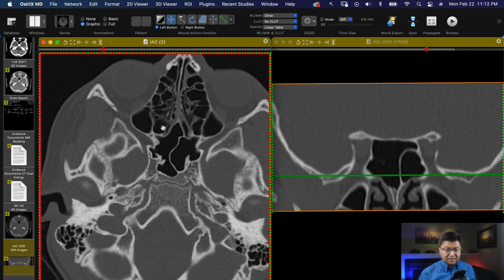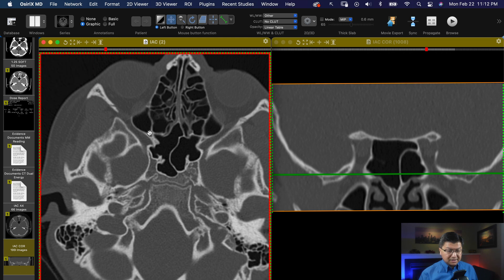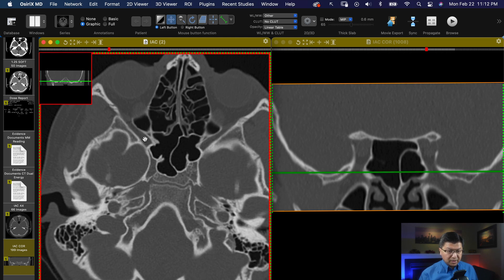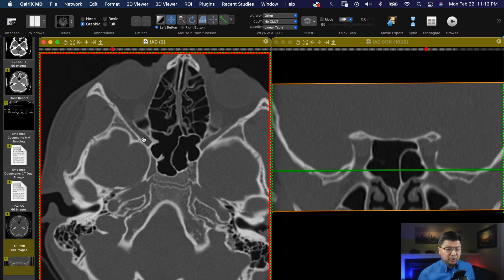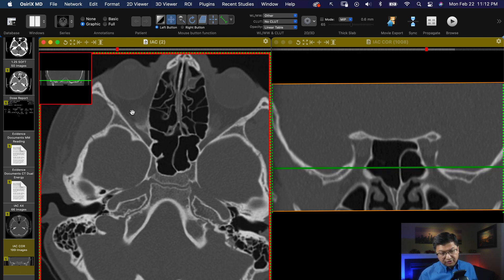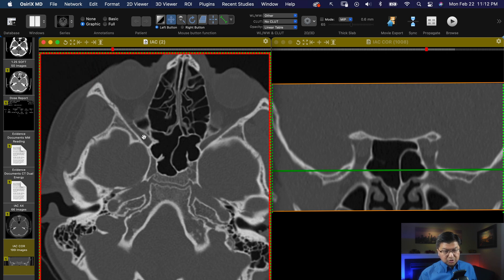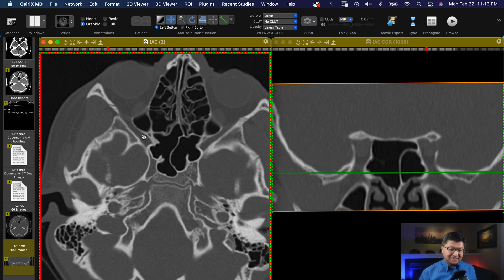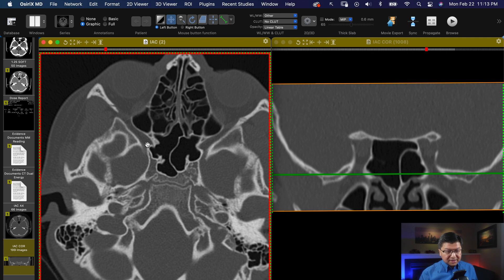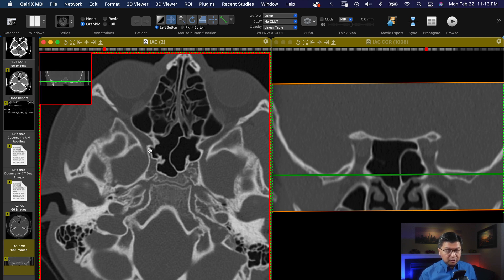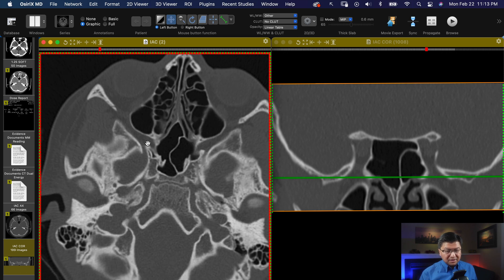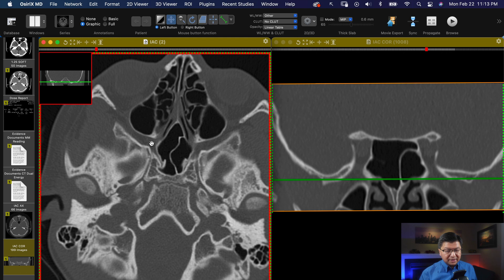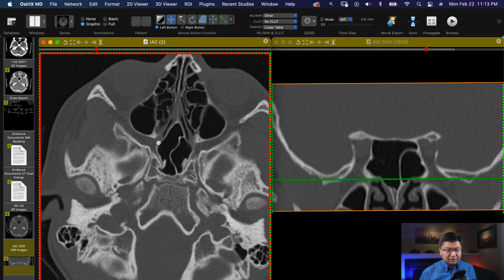On the axial images, going superiorly from the pterygopalatine fossa level, here is the entrance — it's a big fissure, that's why it's called the inferior orbital fissure. So that's another entrance and exit. Now, staying at the same area at the level of foramen rotundum and looking medially, there's a connection here to the nasal cavity — that's called the sphenopalatine foramen.